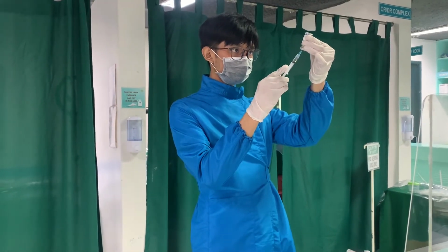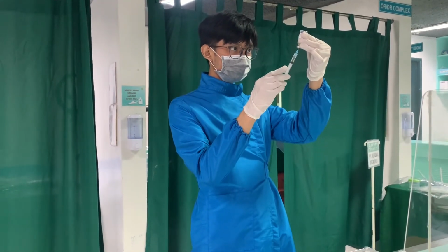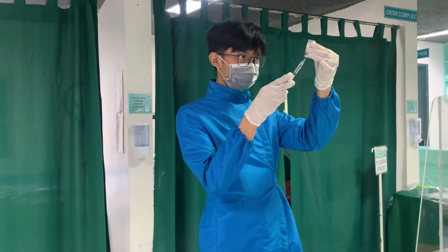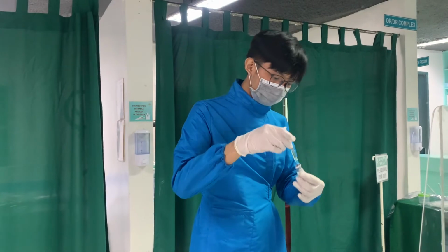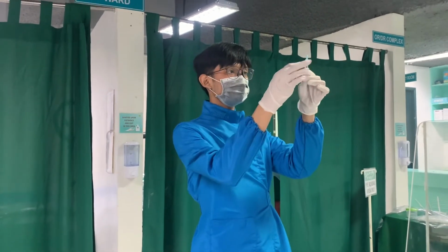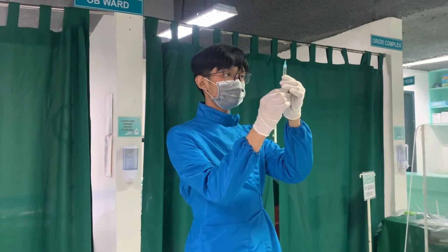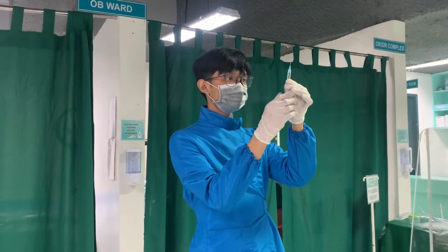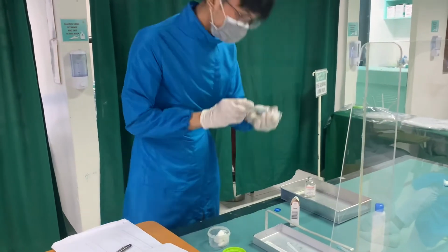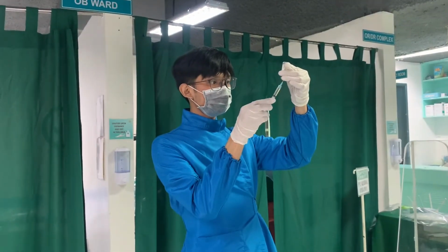Hold the vial on a flat surface, pierce the rubber stopper in the center with the needle tip, and inject the measured air into the space above the solution. Do not inject the air into the solution. Invert the vial, keeping the tip of the needle or blunt cannula below the fluid level. Hold the vial in one hand and use the other to withdraw medication.